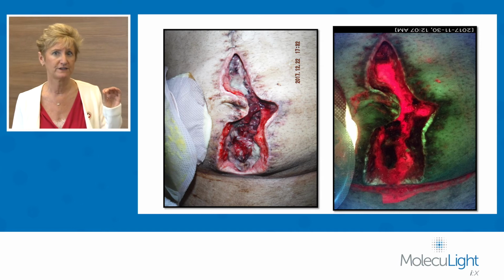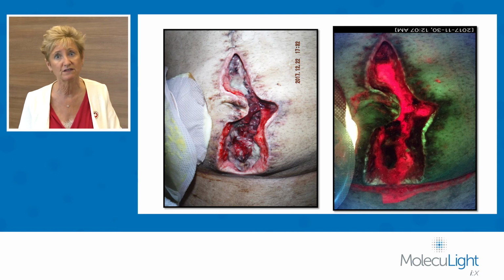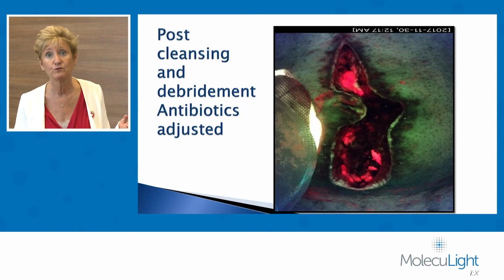This is powerful information because I want you to see not only is the red fluorescing in the wound bed, but the wound exudate has slipped into his skin fold just below his abdomen, and you can see all of that wound exudate, a bright, bright red. That's absolutely heavily loaded with bacteria. And I don't think sometimes we realize, as we're cleansing wounds, the contamination of bacteria to the surrounding area. So after doing that fluorescence, I began wound hygiene, wound cleanup.